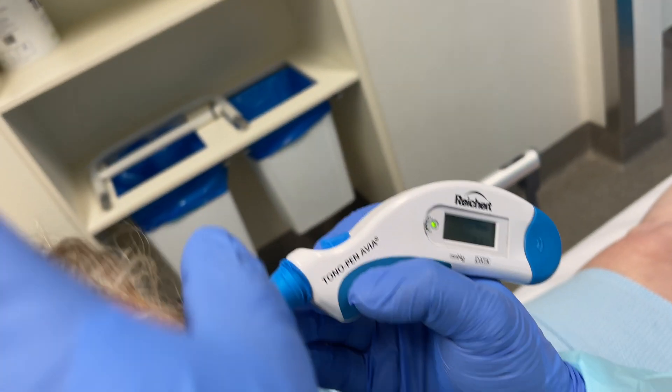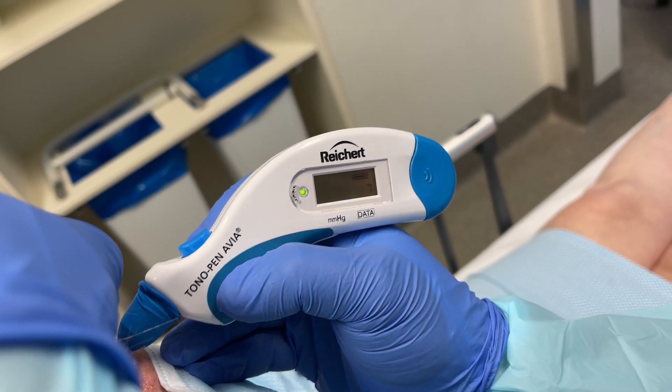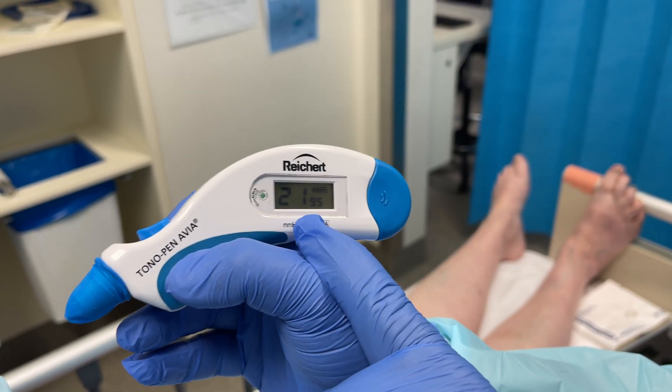Please do not apply pressure with your fingers on the orbit or indent the cornea with the tonometer pen. The averaged pressure on her other eye is 21mm of mercury.